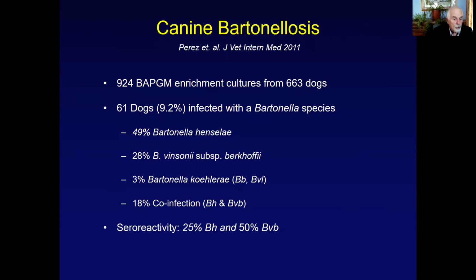And of those that we were able, through enrichment culture, to document their infection, 49% were Bartonella henselae, 28% were Bartonella vinsonii berkhoffii, and 3% were Bartonella koehlerae.